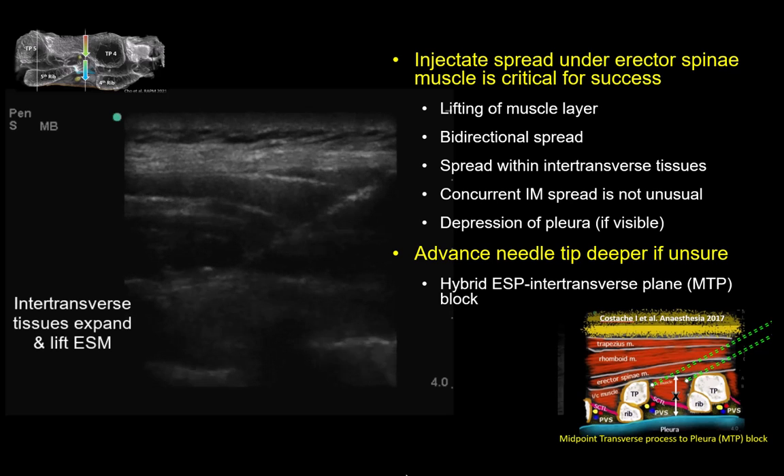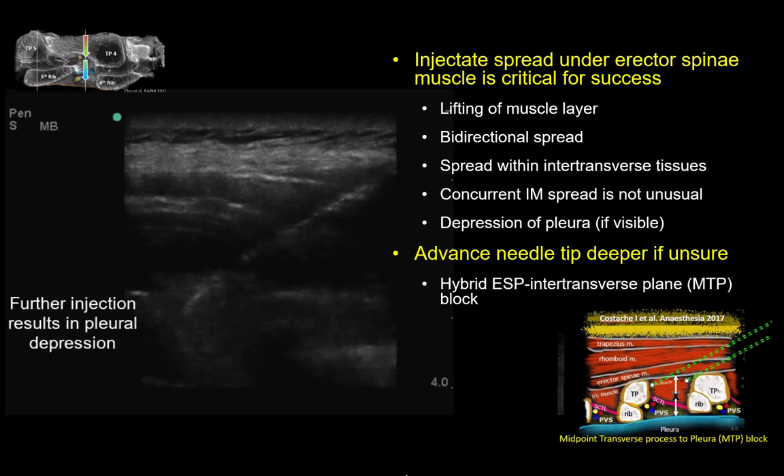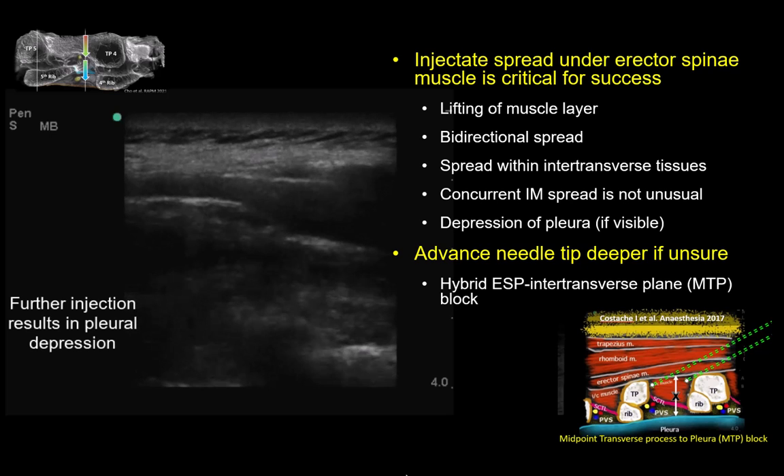At this point, you may see spread in the intertransverse tissues, and in slim patients the pleura may also be pushed down by the fluid injection, as seen here. Some will point out that this is in fact a hybrid ESP intertransverse plane or MTP injection, and I will not argue with this description. Nomenclature is important, but at the end of the day, the most critical thing is to do what works for our patients. And if this means entering into the intertransverse tissues, then this is what should be done.